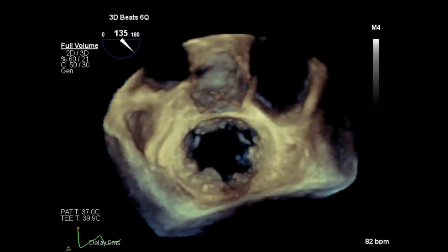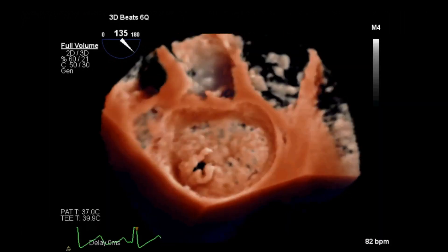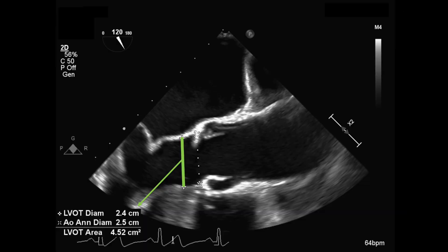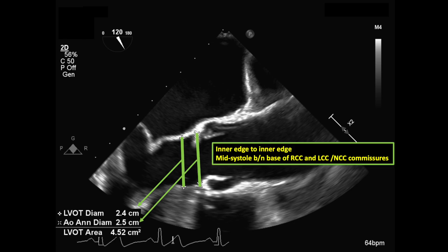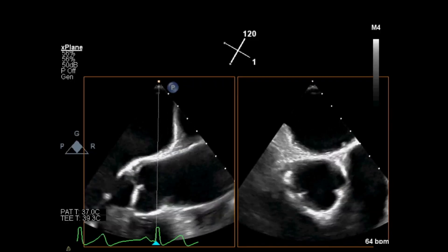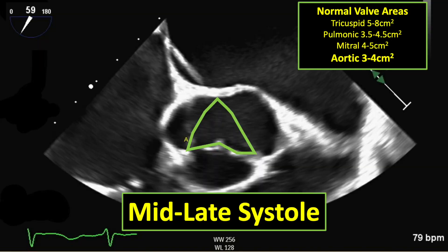I note its anatomy and leaflet integrity, its relationship to the left atrial appendage, aortic valve, and interatrial septum. I then measure the left ventricular outflow tract and aortic annular diameters in mid-systole, and the aortic sinus, sinotubular junction, and aortic root diameters in diastole. In the short axis, I can obtain an aortic valve area by planimetry in mid-systole.